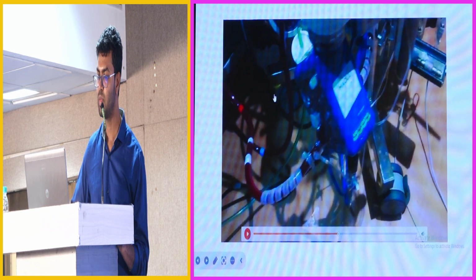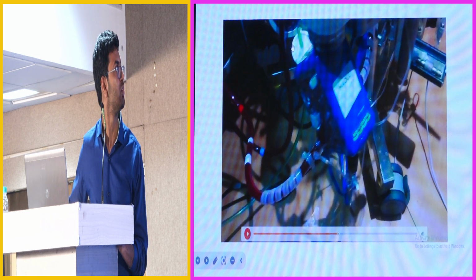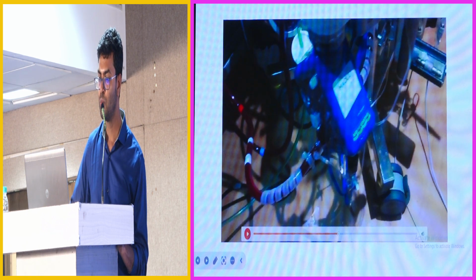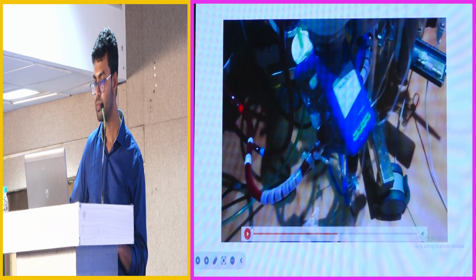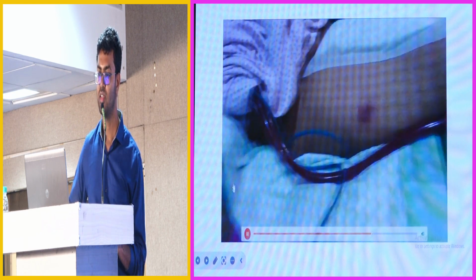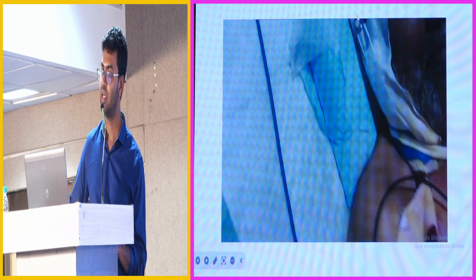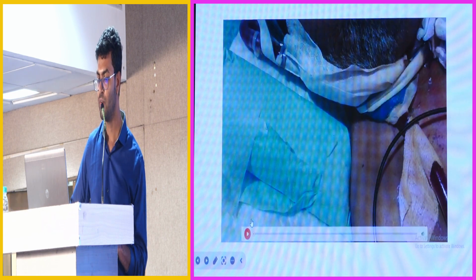If you see, the color difference will be there. Here also you can see this is red color, this is a dark color. This is the gas inlet into the oxygenator, and these two blue pipes are the water circulating pipes into this oxygenator. The blood will come outside, and then this is our returning cannula. The returning cannula, we secure it to the patient's chest, and the cannula will go like this and then enter the IJV. Okay, so this is how we do a VV ECMO.